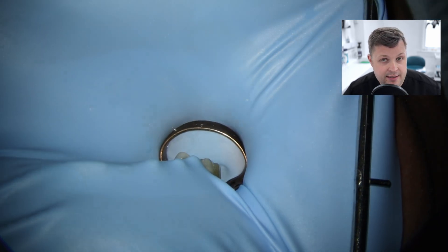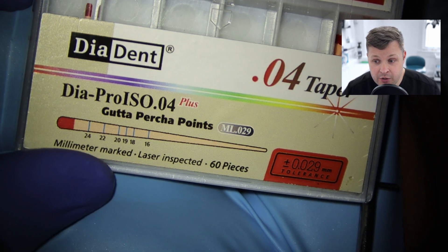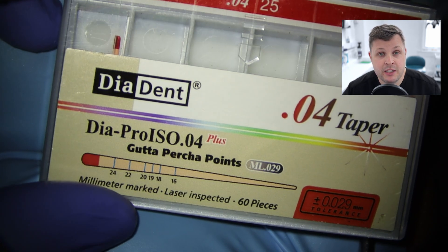There's also no change in dentine color. What I'm going to do now is a cone fit radiograph, and I'm going to use these really narrow tapered GP points. This is because the access is so small - if you were to use a normal high flex variable-tapered GP cone, it wouldn't fit in the access cavity. And because we're using a bioceramic, we can use these smaller tapered GP points, and obviously the canal space is going to be filled up.